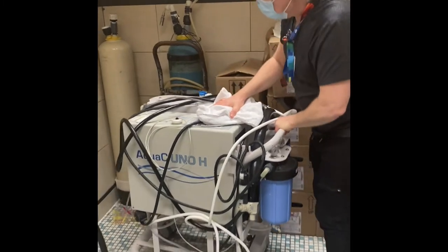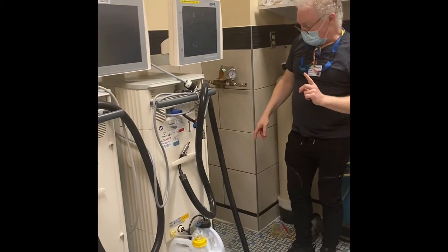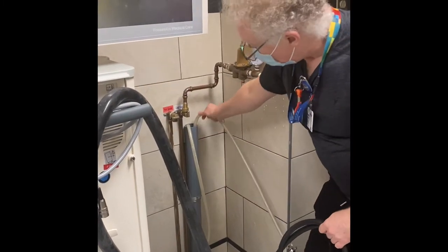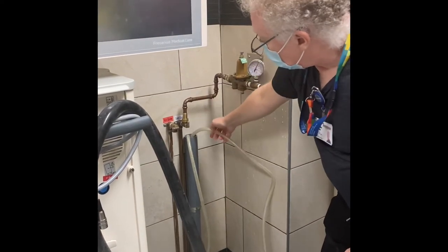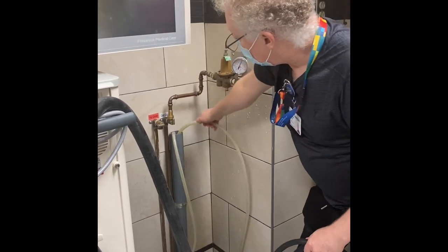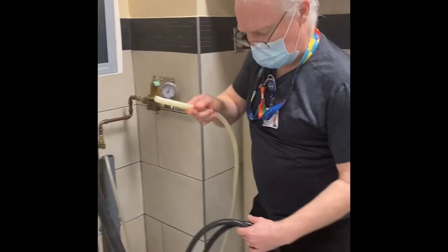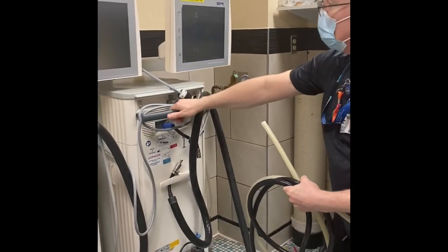Pull the dialysis machine out from the wall. You've already unplugged the power. You just now need to unplug the drainage hose, which is in the grey piping. Just pull that out and allow the water to drain out as you pull it. Now the machine is ready to move.